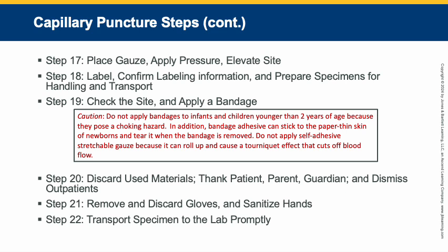Step number 20. Discard used materials, thank the patient, parent, or guardian, and dismiss outpatients. Step number 21. Remove and discard your gloves and sanitize your hands. And step number 22. Transport the specimen to the lab promptly.